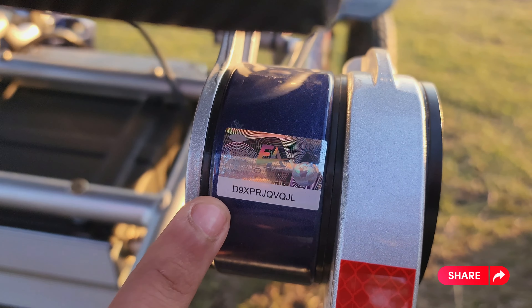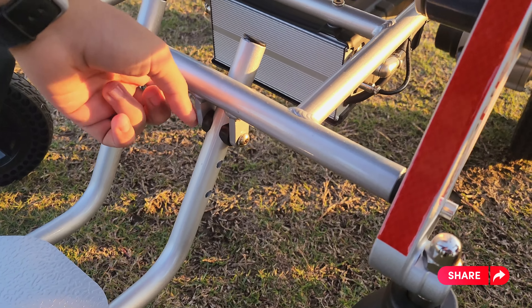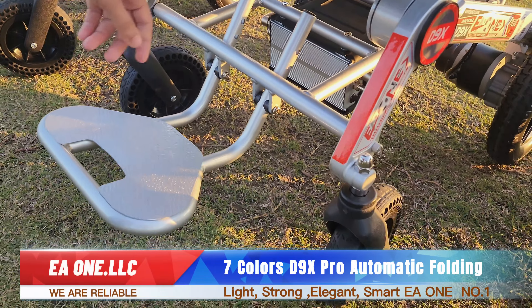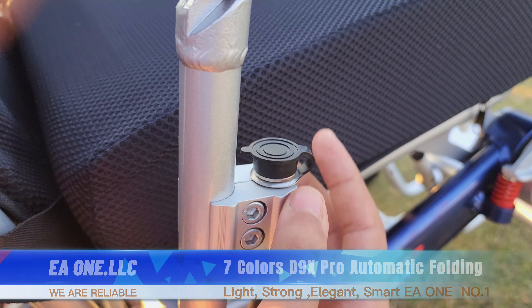Here's our own watermark sticker that proves this is our wheelchair and it's not bought from a third party. We also have an extension for our leg rest — you can see this one is very low and this one is very high. You can determine that by these three holes, which you put the screw in through to make them lower or higher.